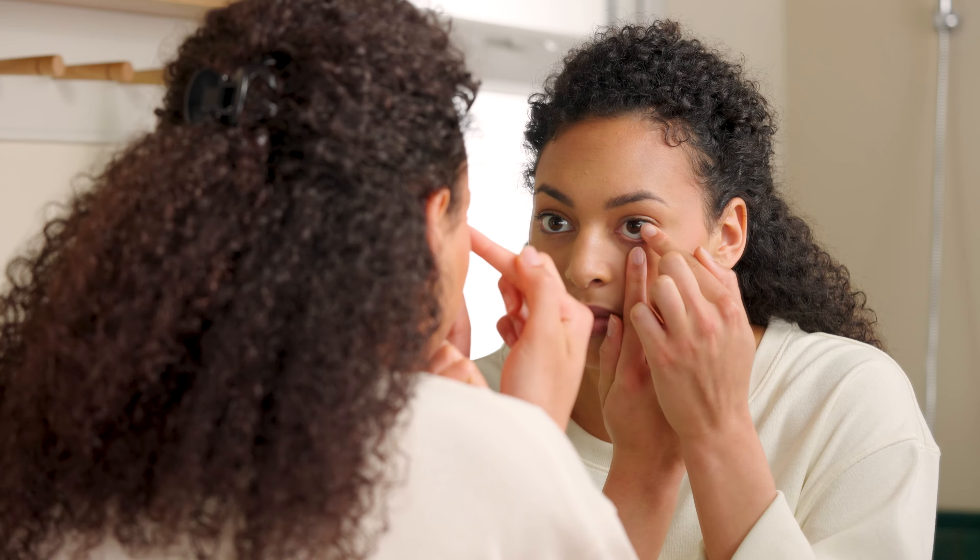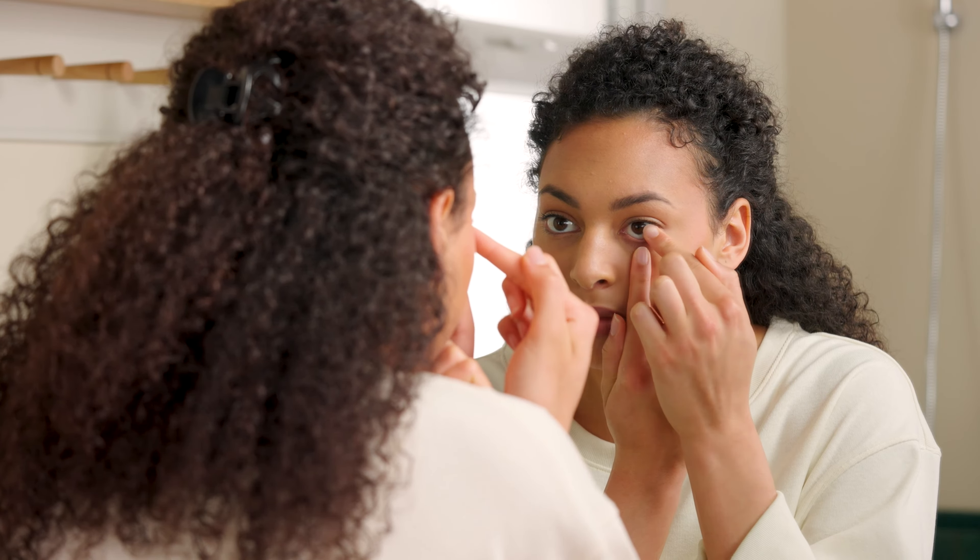If it doesn't quite feel right, place your finger on the lens and slide it across to the white of your eye, and then slide it back again. This gets rid of any air bubbles.